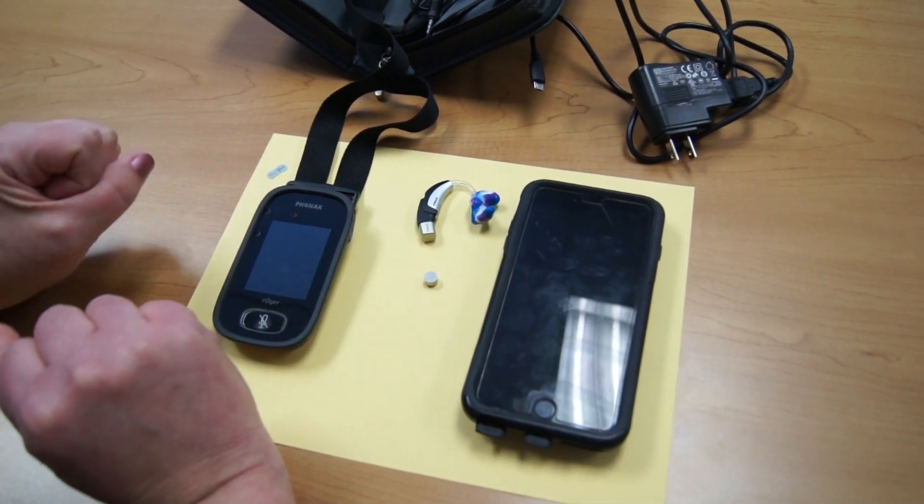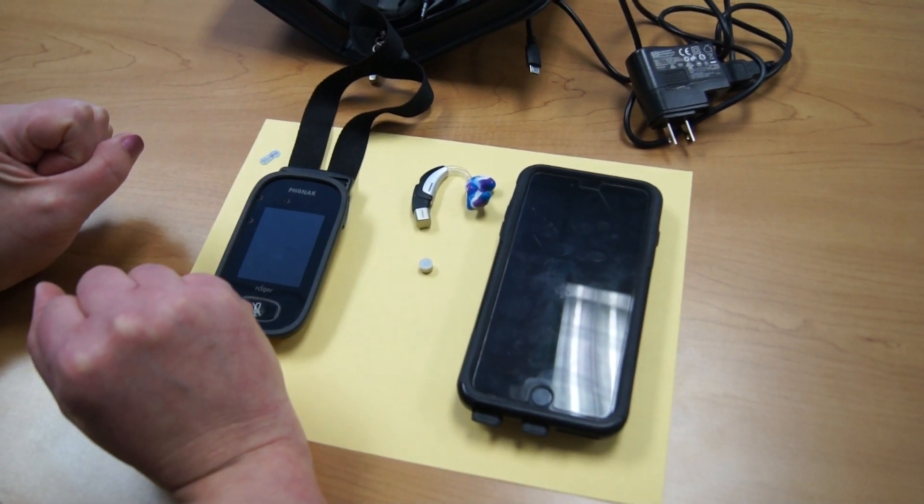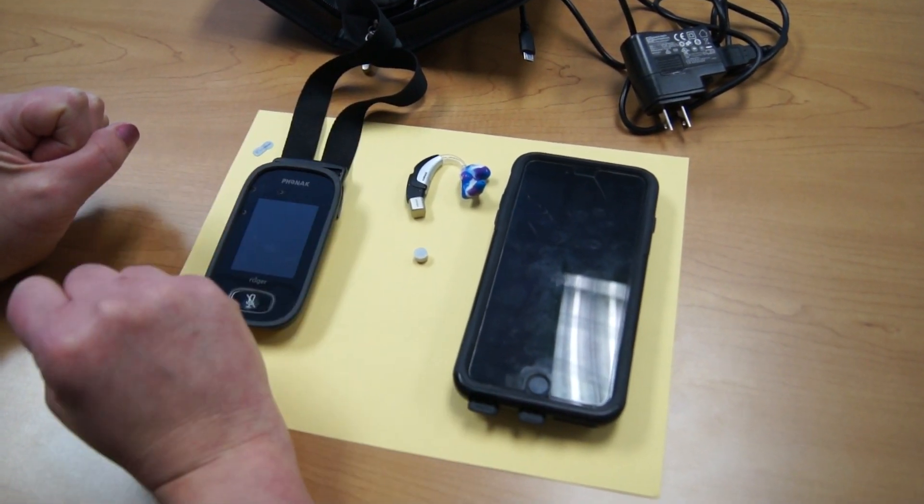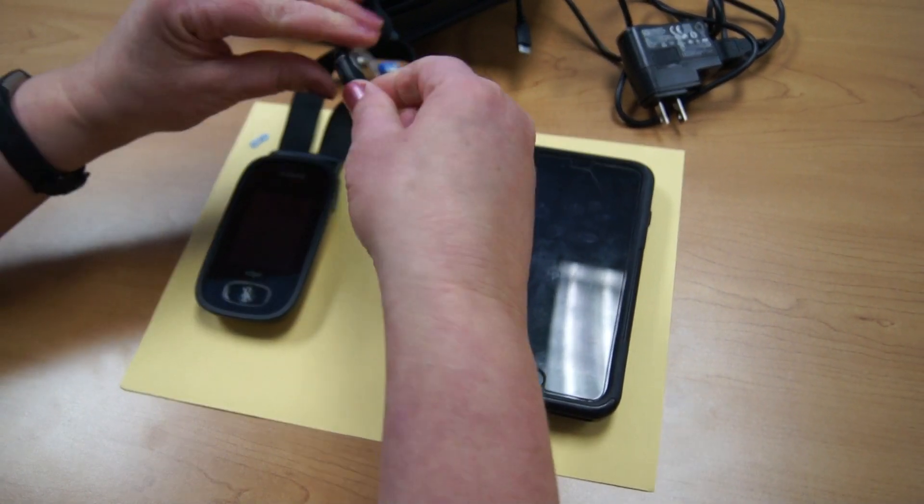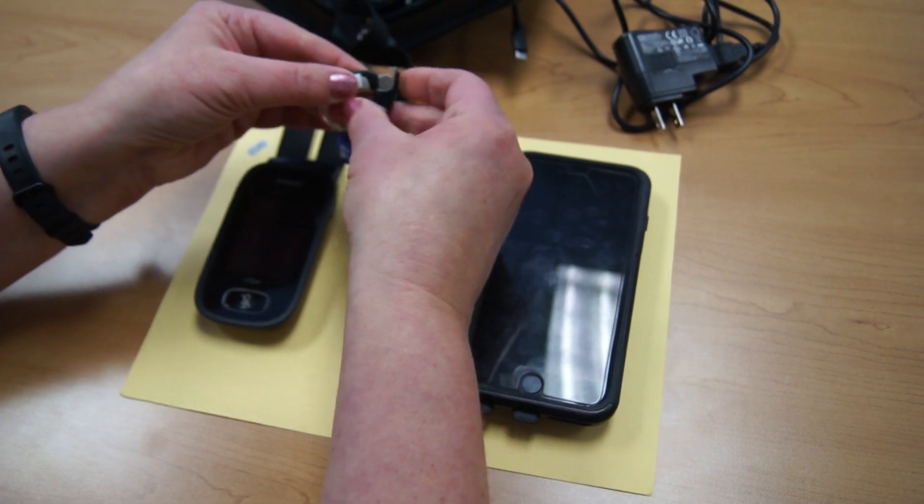Let the battery sit five minutes. The battery runs off of air and needs at least three to five minutes to soak up as much air to activate that battery. Once you've waited the five minutes, you'll open the battery door and place the battery.